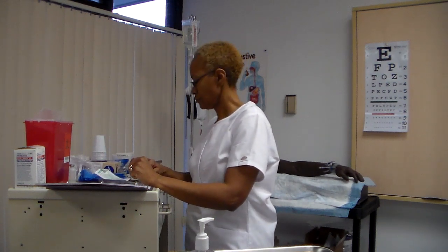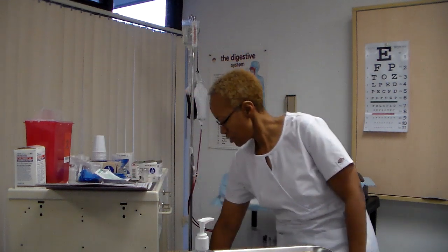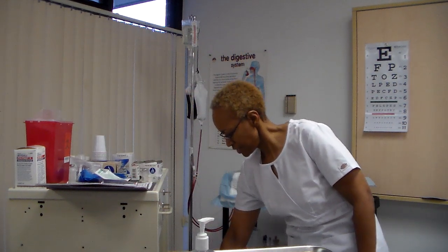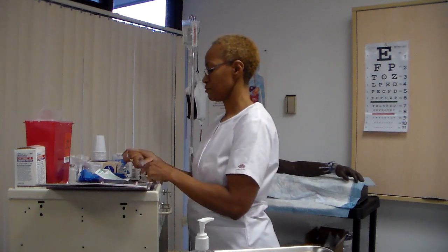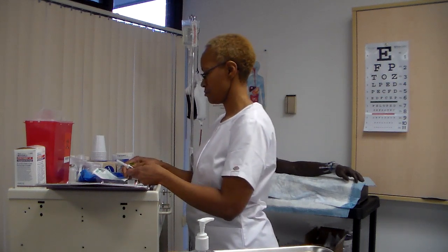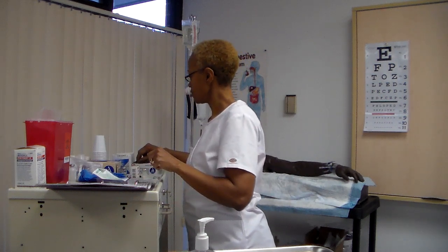Take medication to client at correct time. Identify client using at least two identifiers. Compare label of medication with MAR at client's bedside. Third check. Okay, hold on one second.